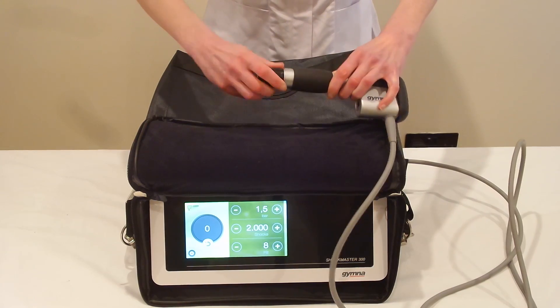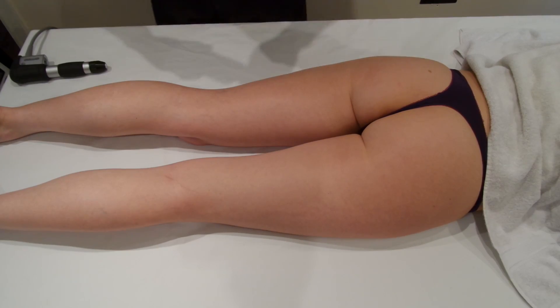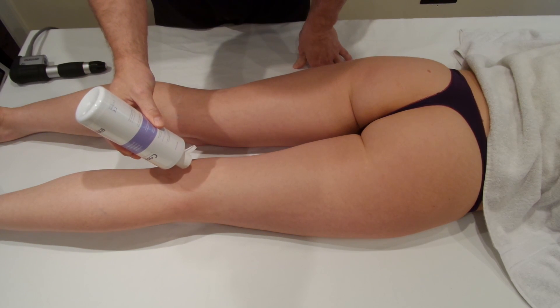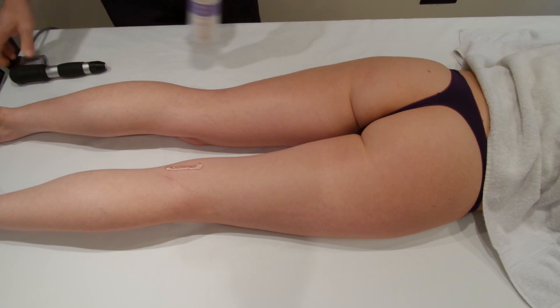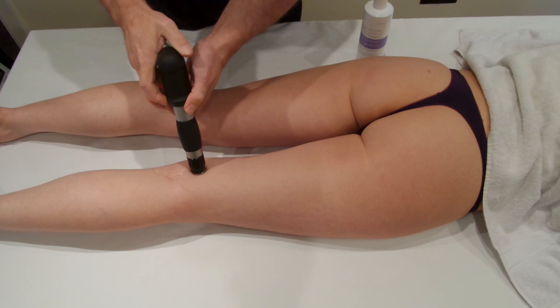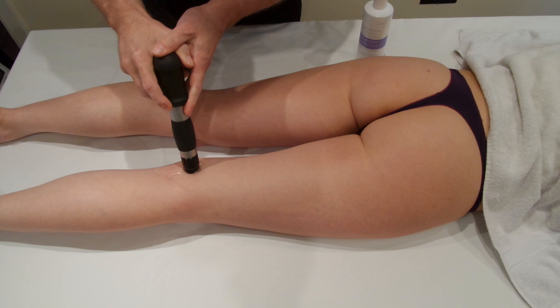The hamstring tendons are very superficial here at the knee. We're going to come onto the back of the knee and apply some gel across the back of the Semi-Membranosis, Semi-Tendinosis tendons. At the knee, Semi-Tendinosis is more superficial. Spread the gel out and then start the shockwave therapy.